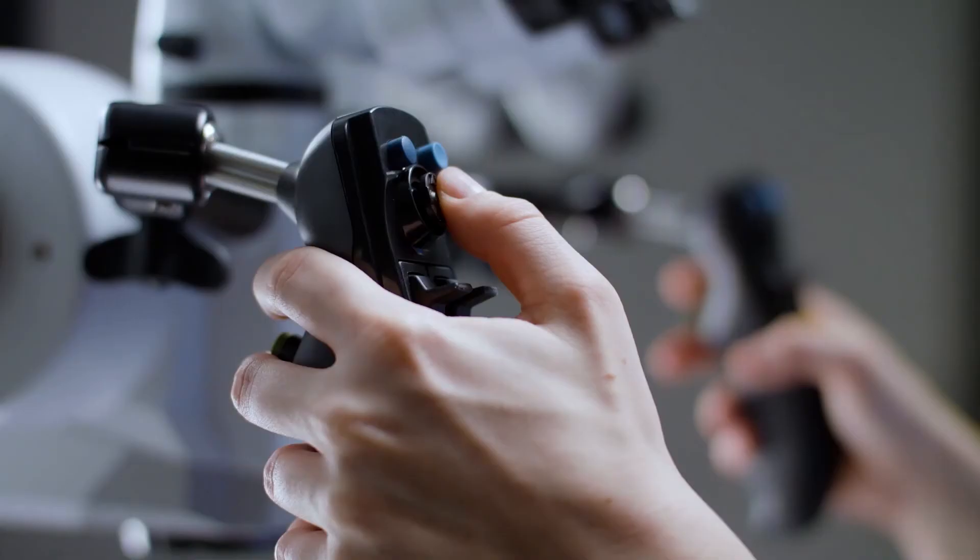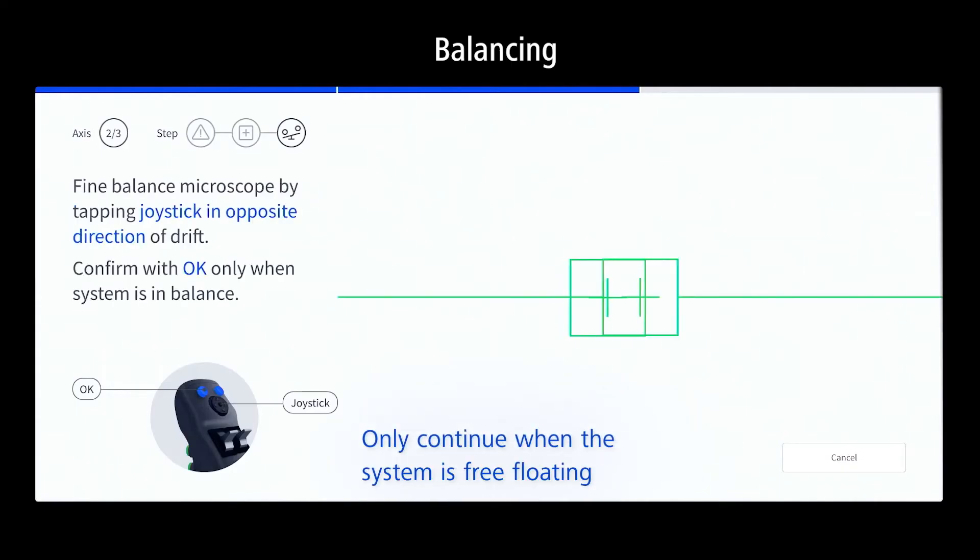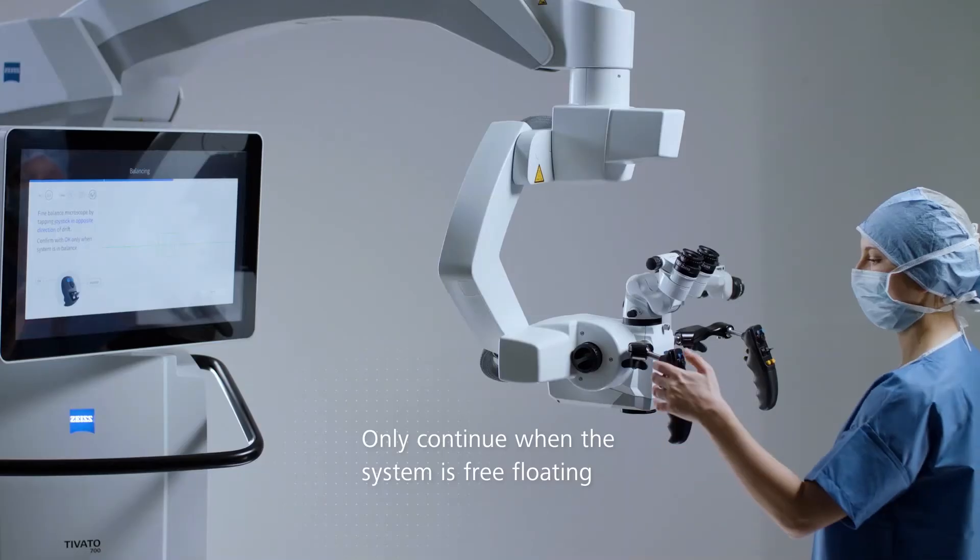Counteract the movement of the system by tapping the joystick in the opposing direction of the drift. If the system moves to the left, tap the joystick towards the right. When balance is reached and the system is free-floating, continue with OK.